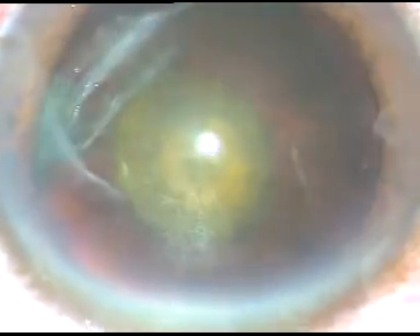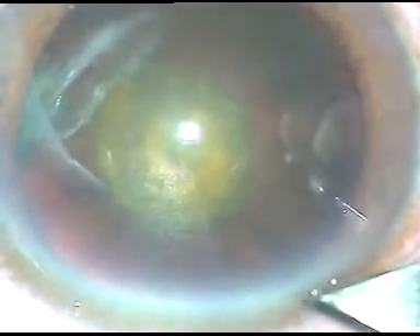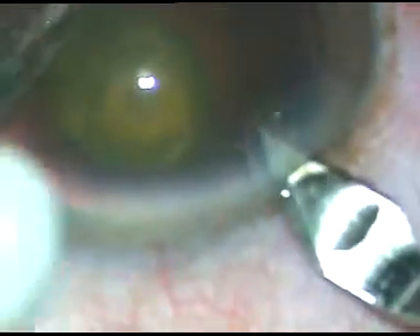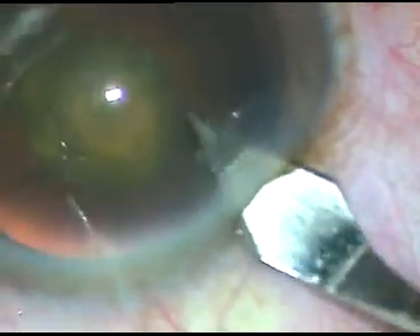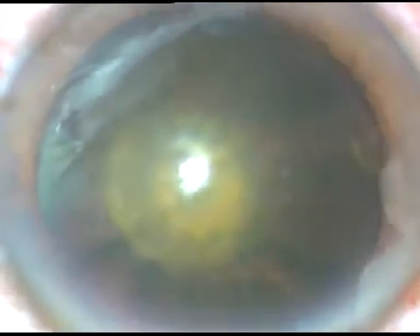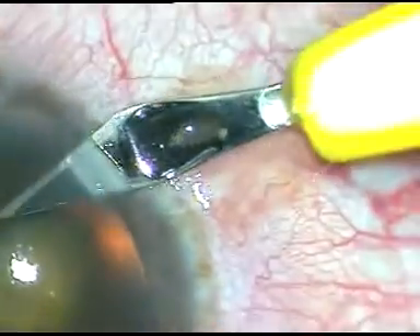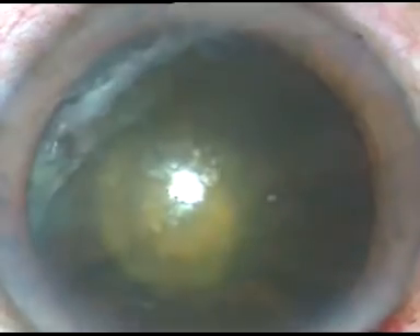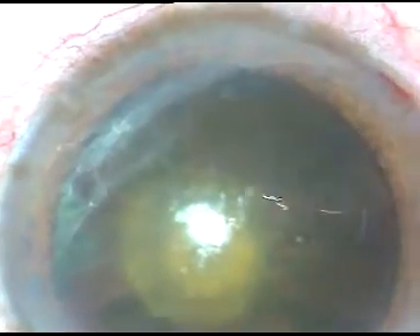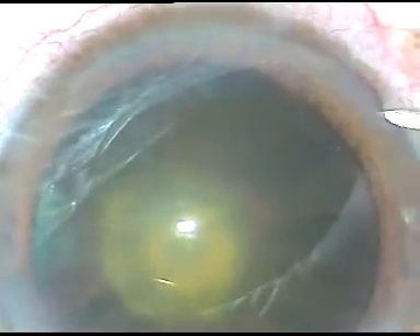Dear colleagues, this is a posterior polar cataract. The other eye has been operated by me a few days back and I had a PC rent. At the outset, let me tell you that if you are afraid of PC rents, do not do such cases. You must acquire courage to deal with PC rents very efficiently and you must be well equipped to do anterior vitrectomy.